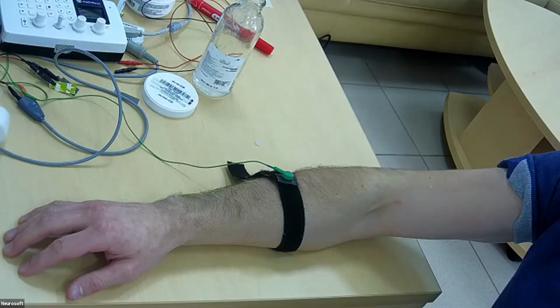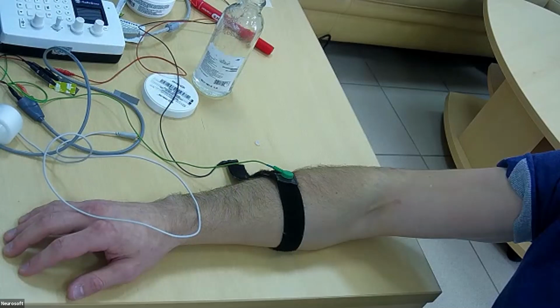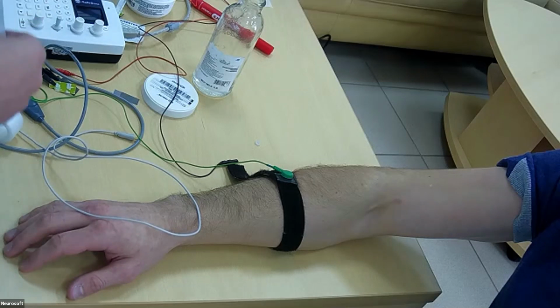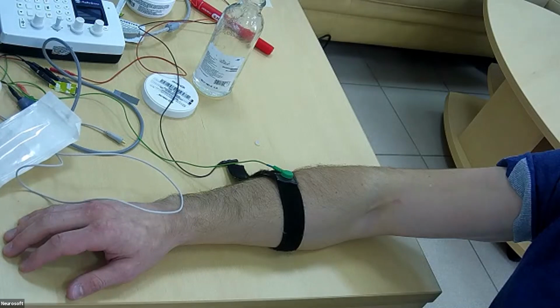Put away some things. So we'll put on gloves. For jitter, we will use small needle EMG, facial needles, or needles for children.